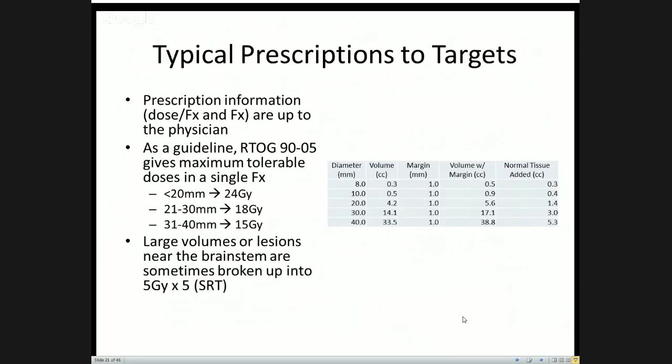If your isocenter error is getting outside of that, that would make me a little bit nervous for SRS, whether you'd actually continue to treat with that. Certainly you can up your margin itself, but just be aware of the increased normal tissue dose that you're getting as a result.